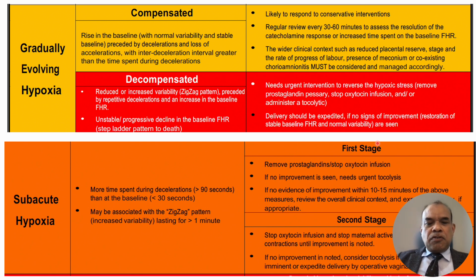And in second stage of labor, as the speed suddenly increases due to increase in the strength of the contractions due to Ferguson's reflex, as well as active maternal pushing, often about 10% of fetuses might show features of subacute hypoxic pattern.